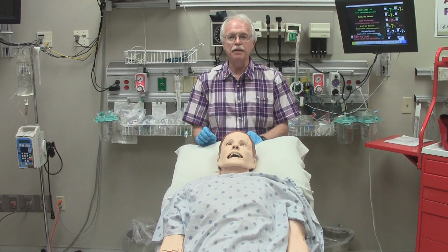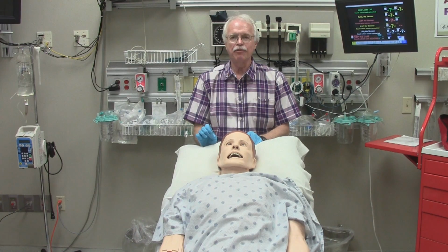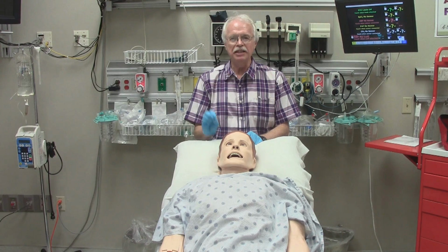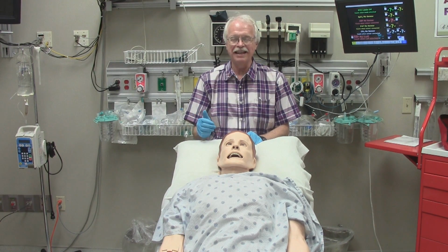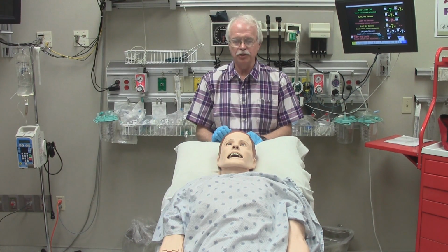It's okay to clean the mannequins with alcohol. Please do not ever put betadine on them. Betadine will stain them orange permanently. If you open any type of kit or tray that contains betadine, please immediately throw it into the trash. Don't bring it anywhere near the mannequins. Again, it is okay to use alcohol on the mannequins.